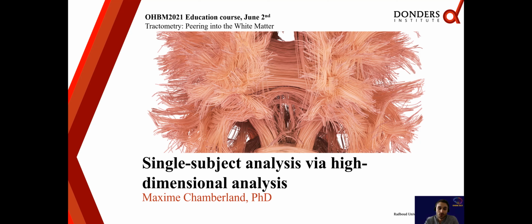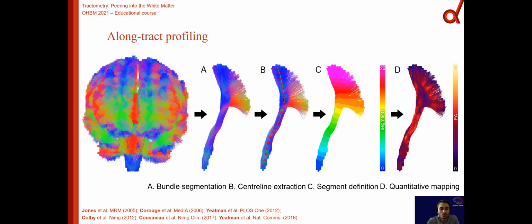Hello everyone. So today we're going to be talking about multidimensional data analysis derived from tractometry. As of now, you probably learned in the previous courses how to derive track profiles, for example. So here is just a brief recap of how we extract these profiles.